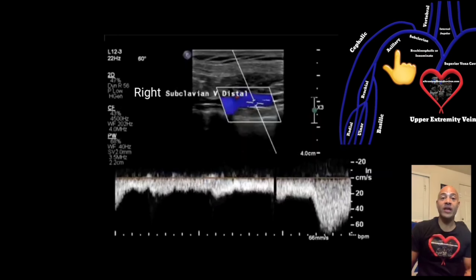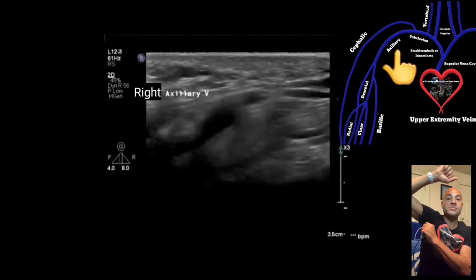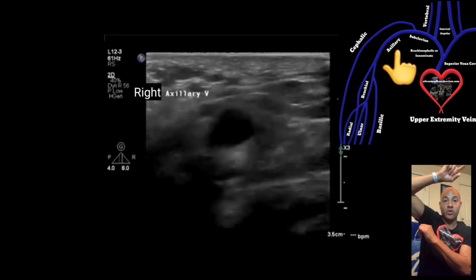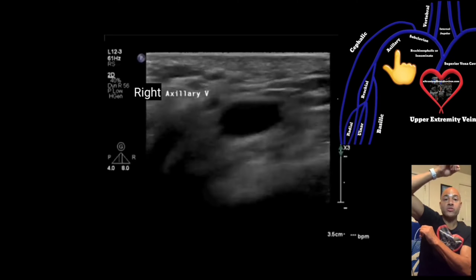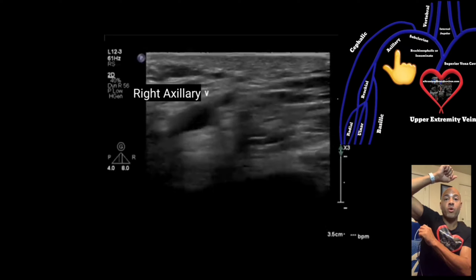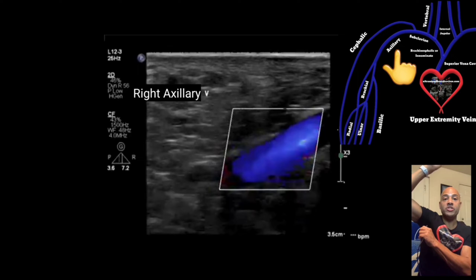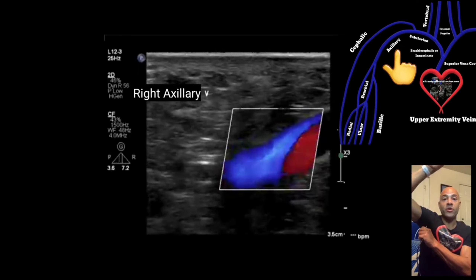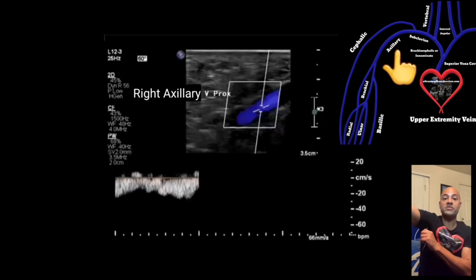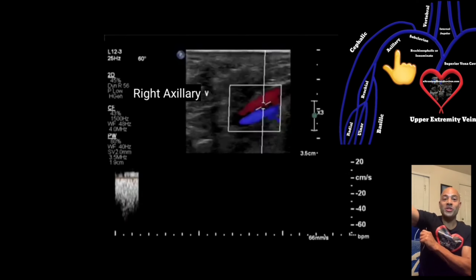Next we're going to acquire images of the axillary vein. If the patient permits, have them lift their arm and place the transducer in their armpit with the index pointed anteriorly. Acquire images in 2D of the axillary vein — it's going to look like a circle on your screen — to ensure there are no DVTs. Then turn your transducer so the index is pointed superiorly or towards the patient's head. Turn on color and acquire color Doppler images through the axillary vein while augmenting the patient's forearm. Then acquire spectral Doppler waveforms with pulse wave while augmenting. You only need to do this in one spot for the axillary vein.